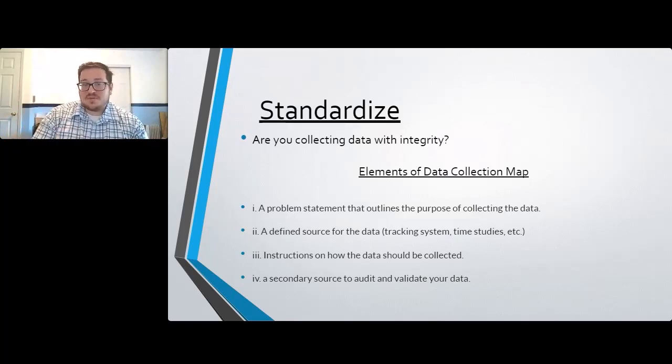The doctor unscrubbed, went home, ate a sandwich, came back. The tray still wasn't up here. Okay, well, that's just part of our reality in SPD. So data can really get you into that objective space where you're saying, no, I know that it took 7 minutes to get from when you made the call to the tray being up here.